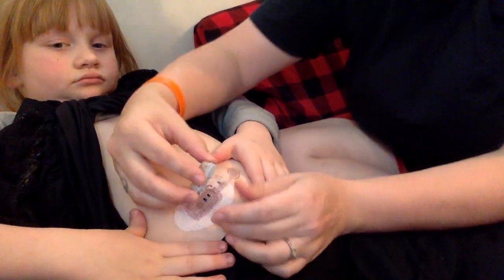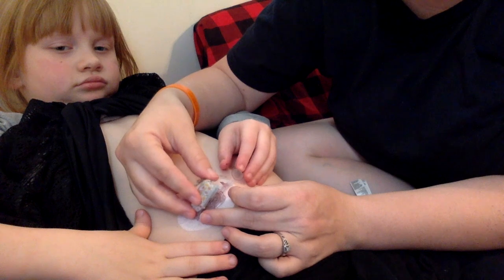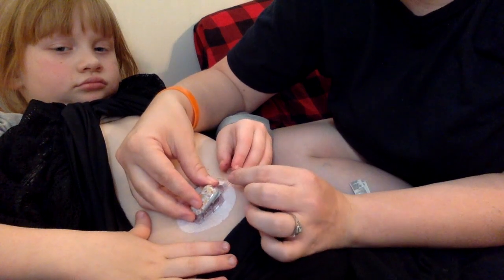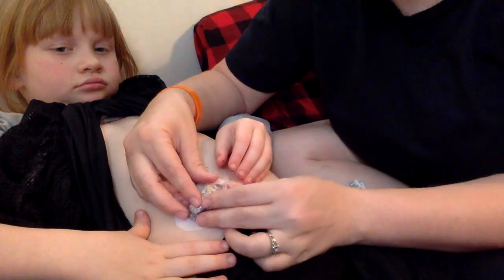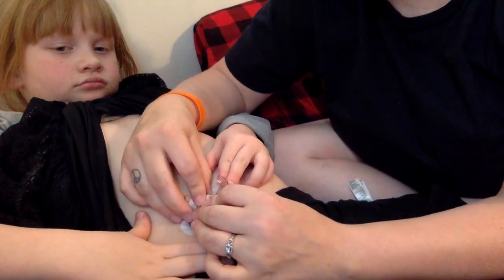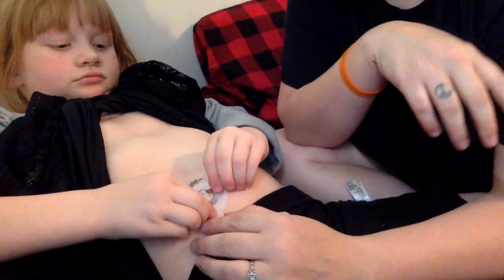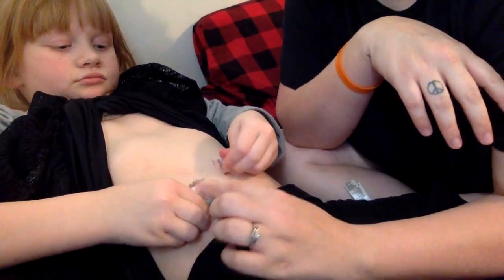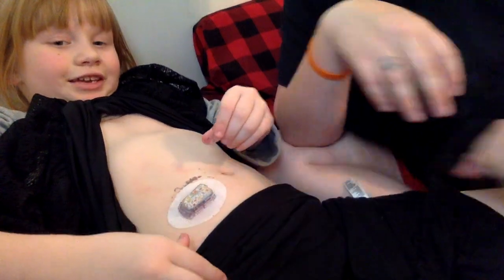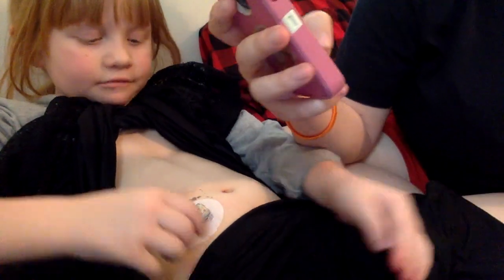Okay, so now what we're doing is... Hold on. You put the small side in away from this part right here, the part that wiggles. You put the small side away, and then go ahead, Sophie. You're going to push this part up until it clicks into place. And you twist it. Just like that. And I'm done, guys. And we're all done.